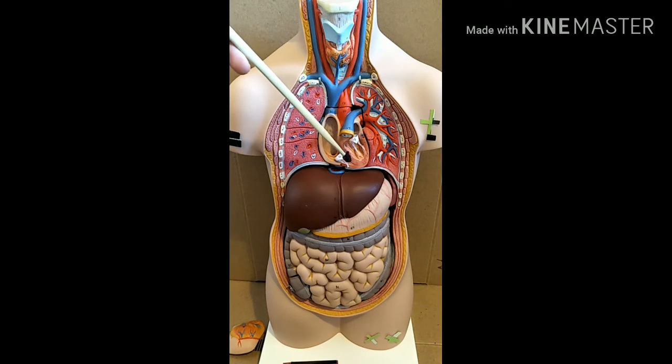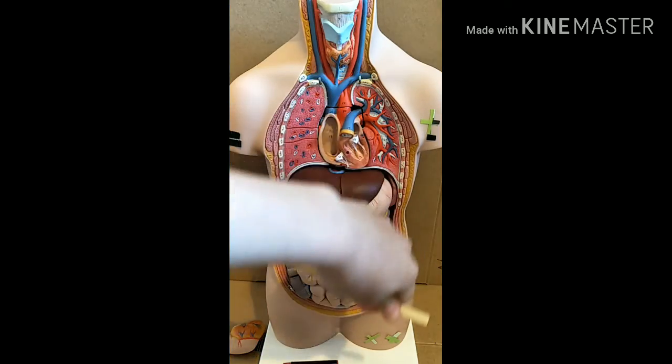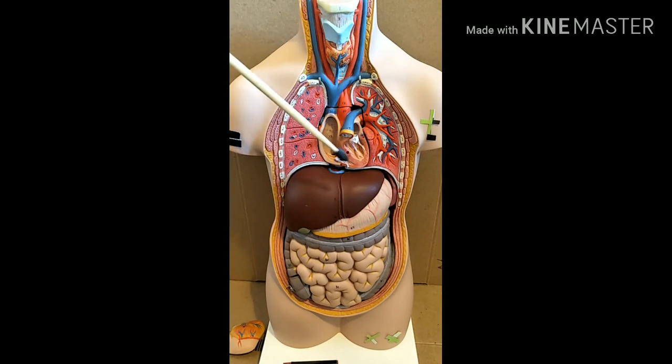And then when you go to the septum, which is the first part to depolarize, there are no small branches that innervate the right septum, so the depolarization wave will move from the left septum to the right septum. Can you see the vector is pointing away from the positive electrode? So the positive electrode of limb lead 1, and of course limb leads 2 and 3, because they're pointing toward this side.